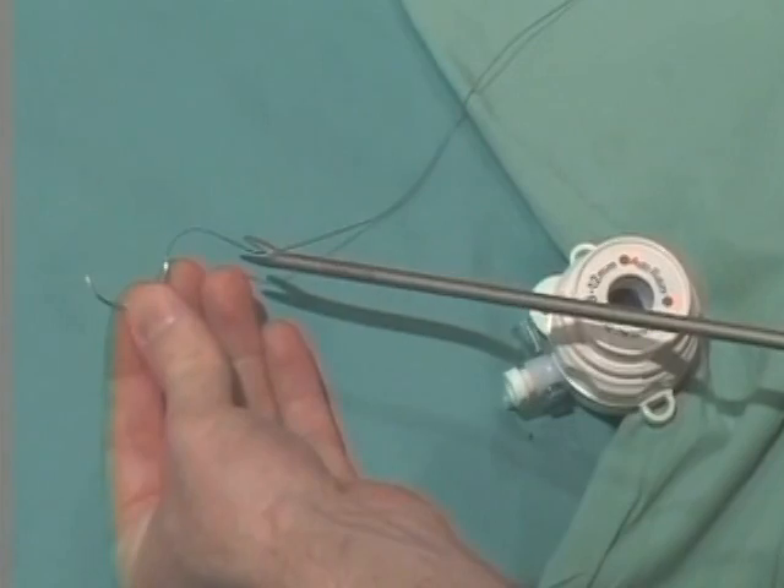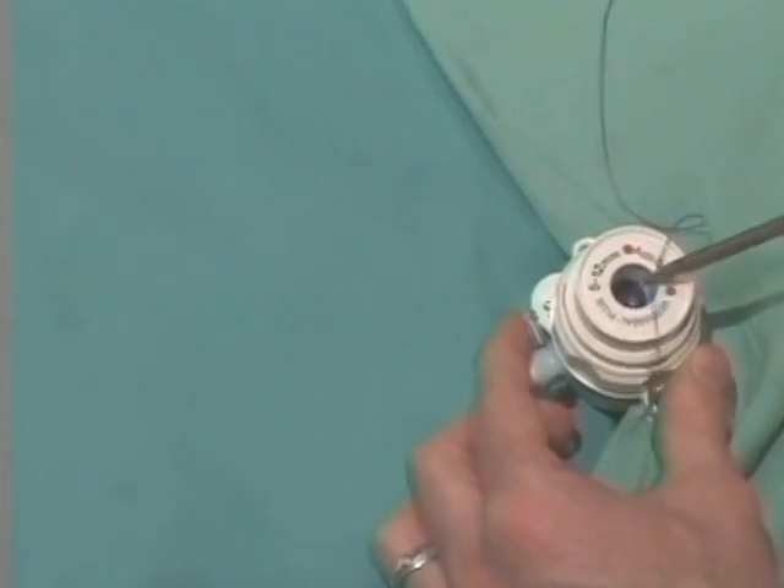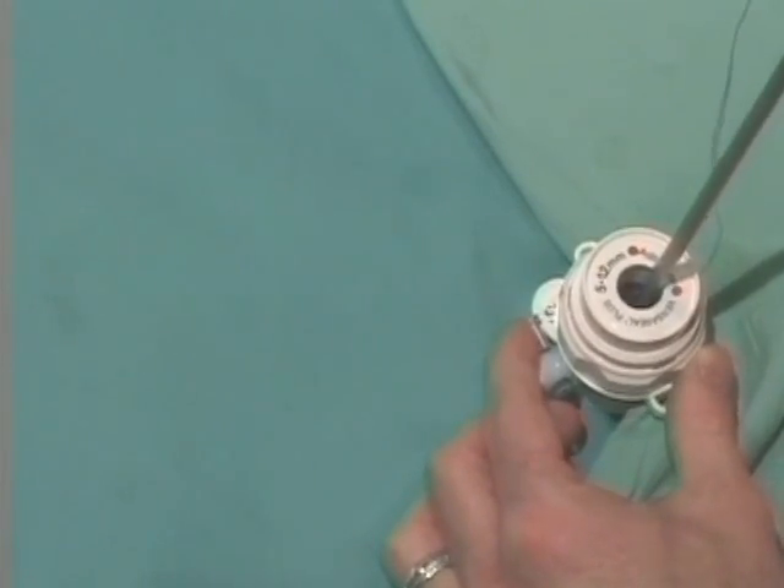There are a few techniques to get the needle into the abdomen. First, the surgeon or the assistant can grasp the suture approximately 2 to 3 centimeters from the needle and introduce the driver and needle into the abdomen.